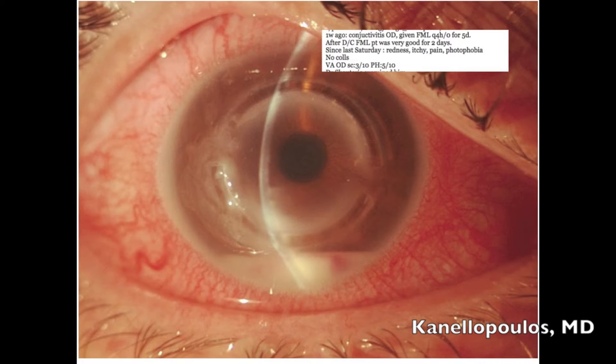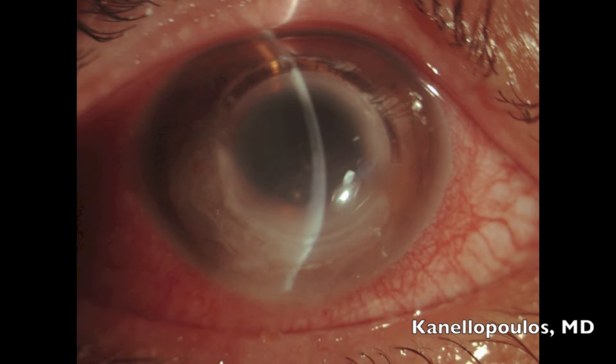As you can see here, he presented in the middle of the summer here in Greece with a serious infection and hypopyon. We treated it with antibiotics. The infection cleared, but then the area in front of the INTAC started to melt. This is the beginning of the melting. It perforated at the 9 o'clock position and we were obligated to place cyanoacrylate glue.